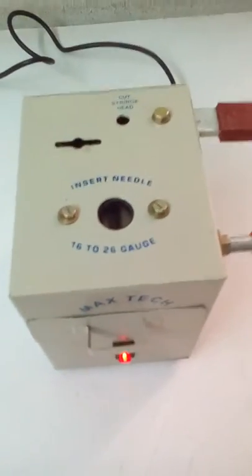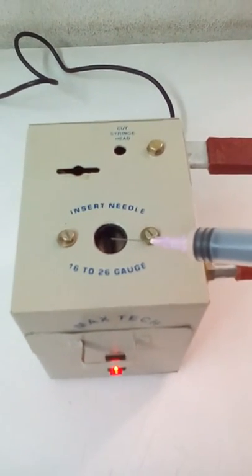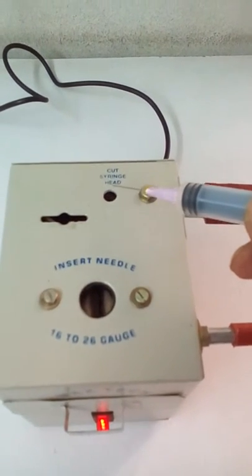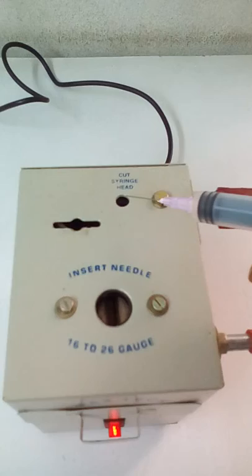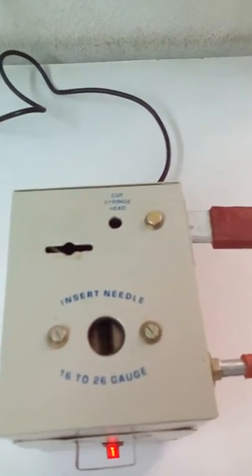This is an electric needle destroyer. Here are the electrodes where the needle will be burnt, and this hole is for destroying the syringe nozzle or syringe head. Now we show you a demo of how it works.